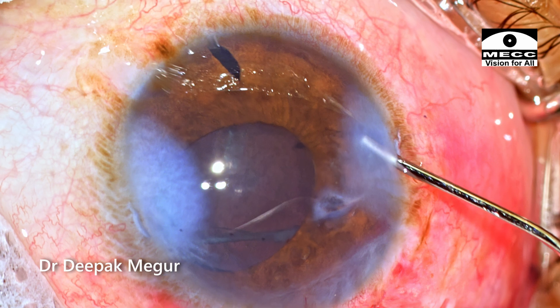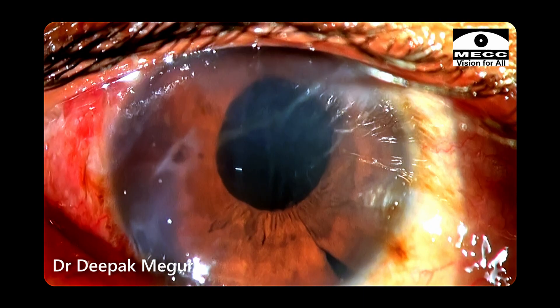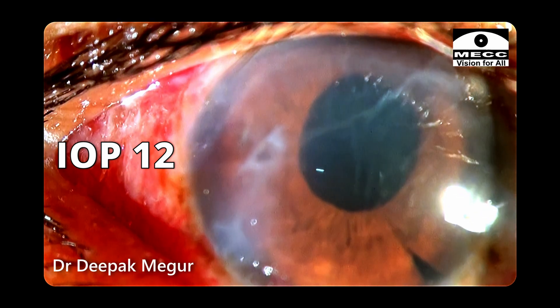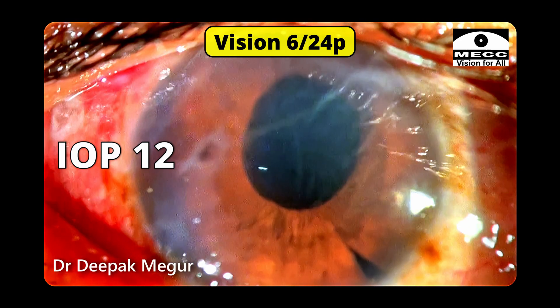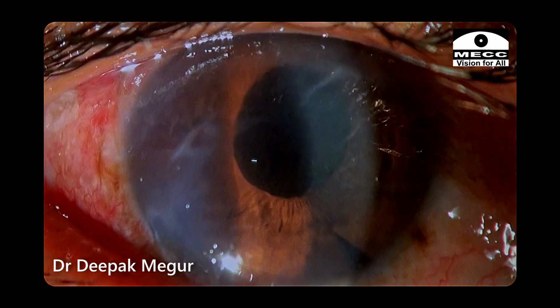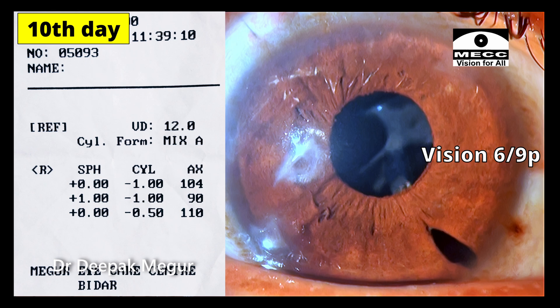The side ports are hydrated and the conjunctiva is closed with a buried Vicryl knot. That's it, the case is done. These are the first day pictures — the cornea is better although still steamy, pressures are alright, and inflammation looks to be not very bad. The patient has a vision of 6/24 and she was quite happy given the preoperative counselling of very poor prognosis. She continues to do well and these are pictures about 10 days later.